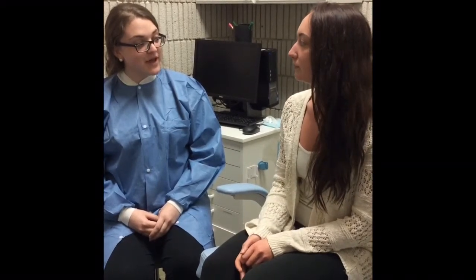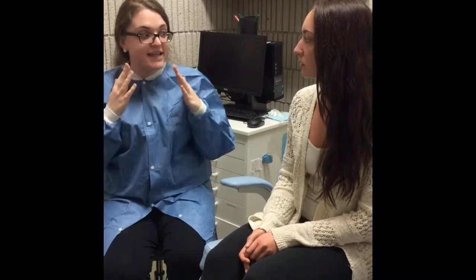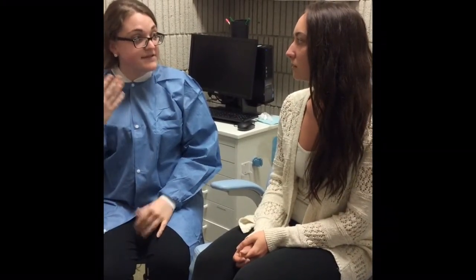Oh no. Okay. Well, then we definitely need to get a 3D image to see what is going on in there. Okay? And the difference between the 2D image and 3D image is that the 3D will really show the full jaw and get a 360 view of it to see if there's any fractures or if there's any damage to it. Okay, yeah, because I really feel like something's wrong. Definitely. We'll get that done, and then we'll figure out a treatment plan for you to fix this and get any help that you need. Thank you. You're welcome.